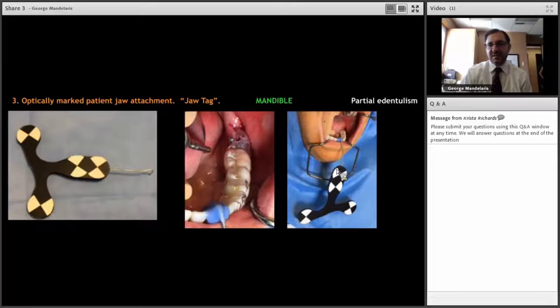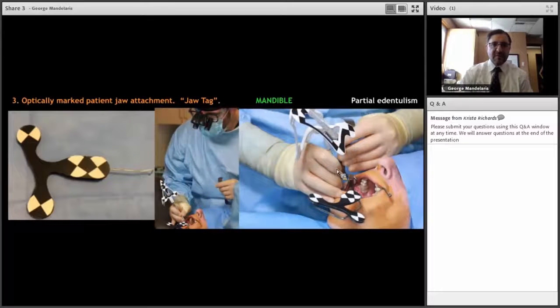Because there's some level of freehand with this, I'm using the navigation software, but I'm also looking at a computer screen. I like to have some reference of tooth position. So I'm still using some sort of suck down to validate exactly what's occurring. And this is great for my referral doctor to see, because they know that I'm executing the surgery with their best interest at heart, and I'm using the leading edge technology to get it as accurate as possible.